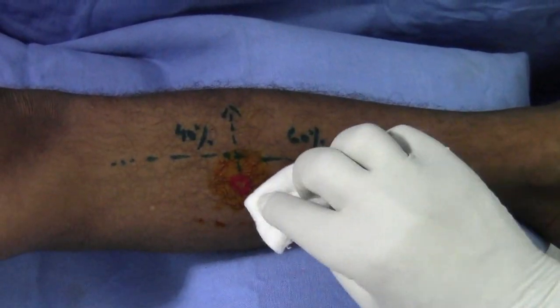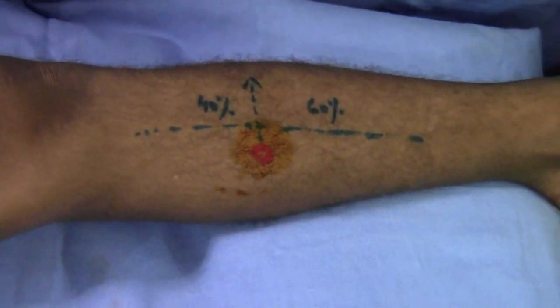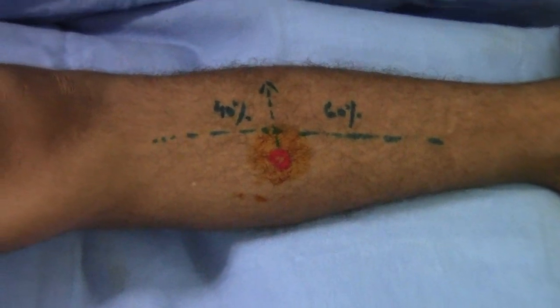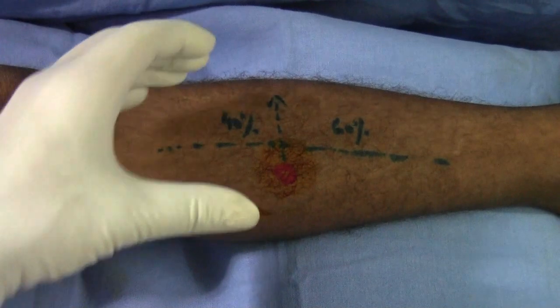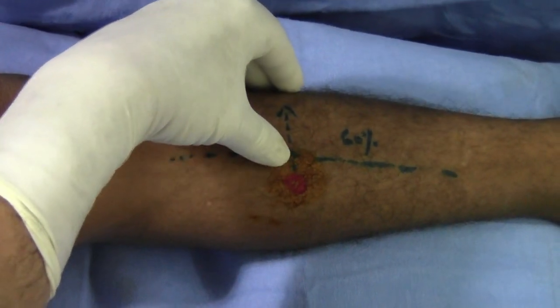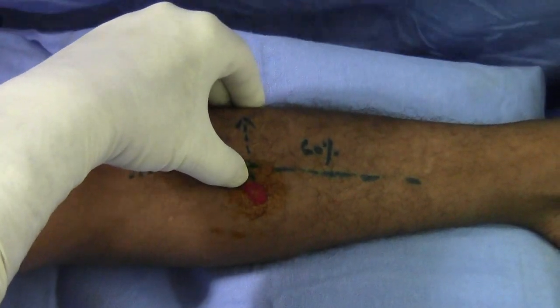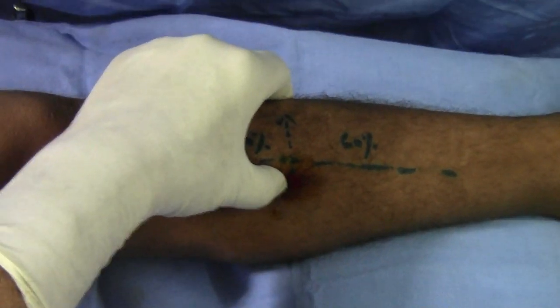The area has been cleaned with betadine solution, and the limb is already sterilized. With the help of the thumb, place the thumb just behind the middle border of the tibia at this point — you can feel the depression just behind the medial border of the tibia.